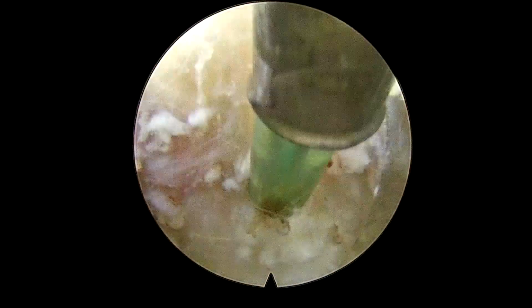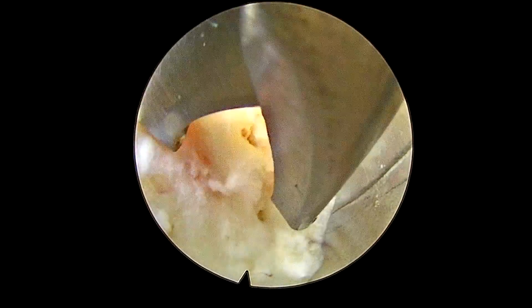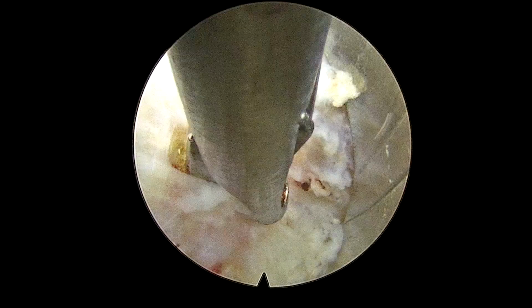Now here I am preparing the ligamentum flavum for the flavotomy. I am just clearing tissues all around, identifying the landmarks. The yellow structure which you can see here is nothing but the ligamentum flavum. So now the next step is flavotomy. As we have discussed already, we are going to start our flavotomy as close to midline as possible.